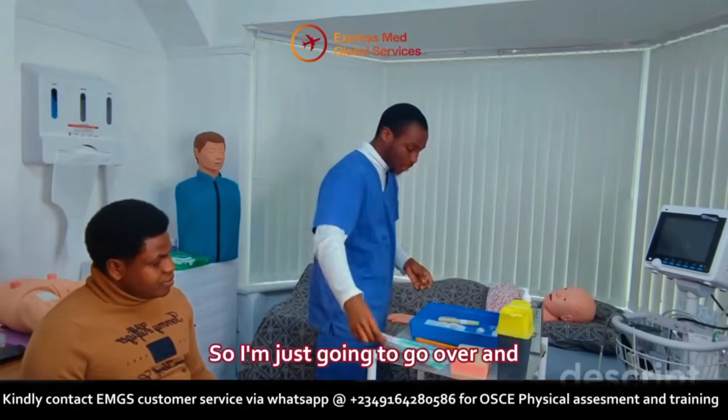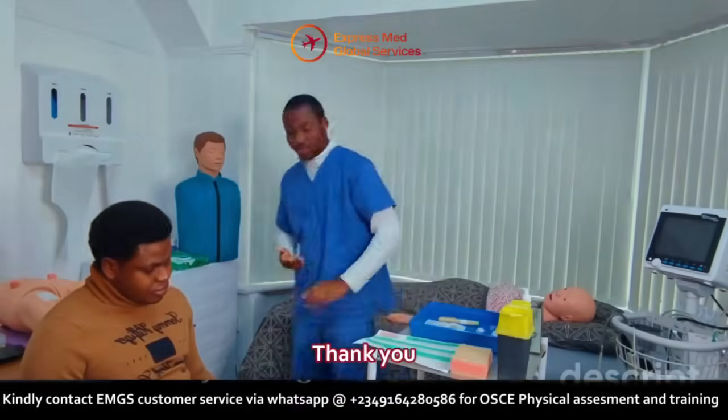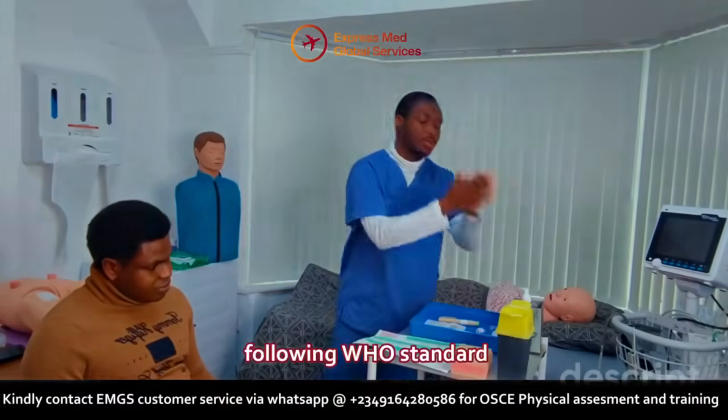So I'm just going to go over and wear my gloves and apron, and go ahead with the procedure, alright? Thank you, nurse. So I'll perform my hygiene again, following the WHO standard.